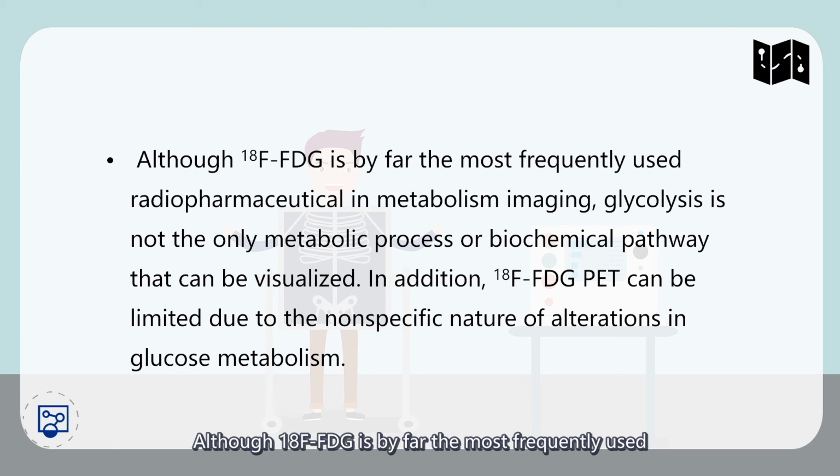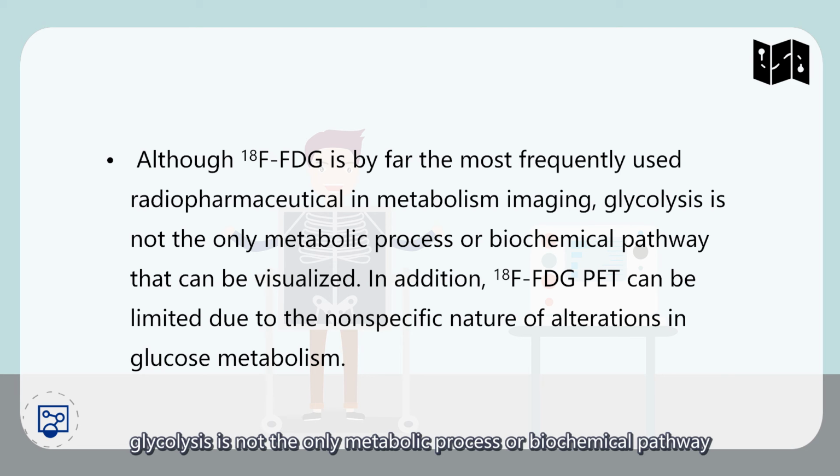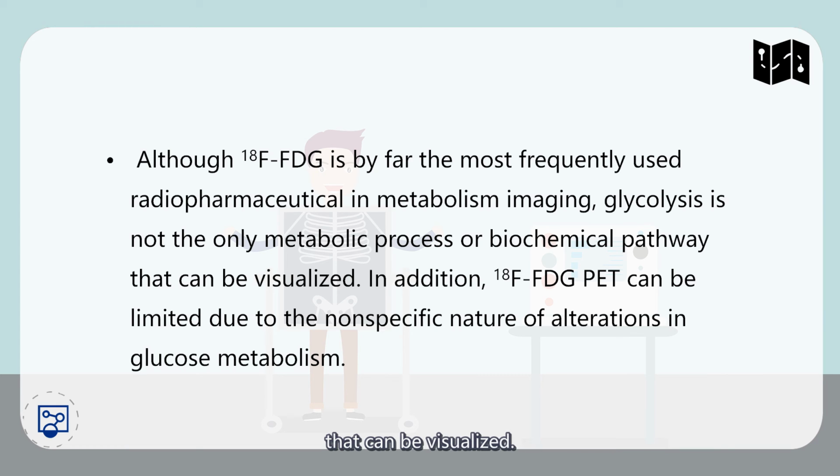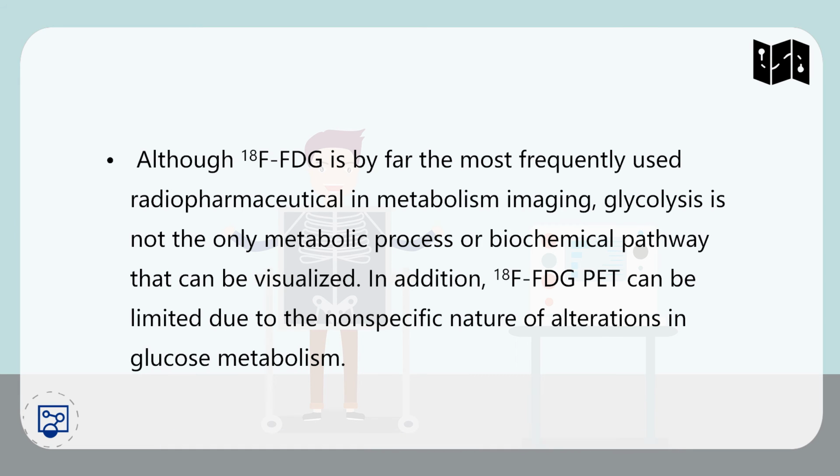Although F18-labeled FDG is by far the most frequently used radiopharmaceutical in metabolism imaging, glycolysis is not the only metabolic process or biochemical pathway that can be visualized. In addition, F18-FDG PET can be limited due to the non-specific nature of alterations in glucose metabolism.